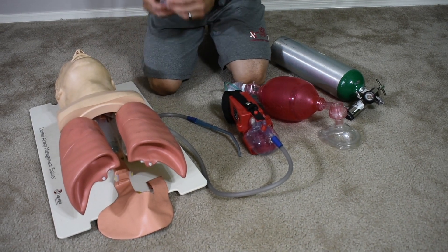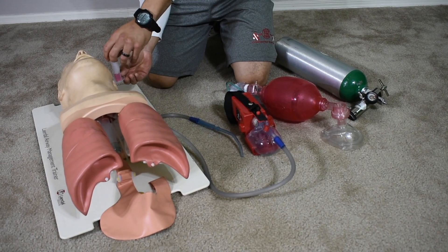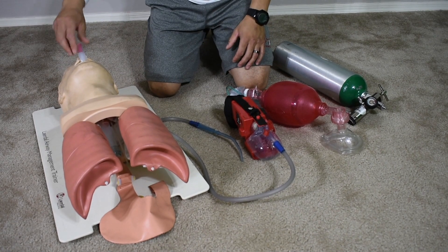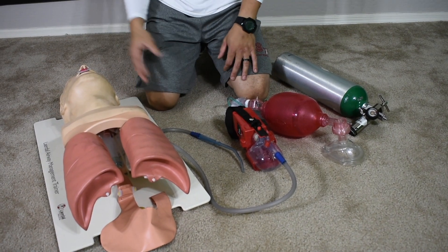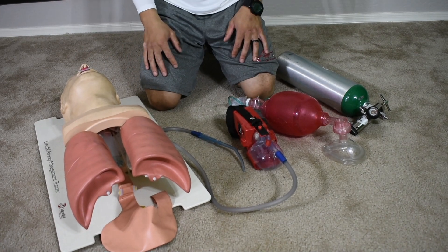I'm going to insert a properly measured OPA, from the corner of the earlobe to the corner of the mouth. Insert it, then turn 180 degrees so it sits on the lips. Does my patient accept? Patient accepts.